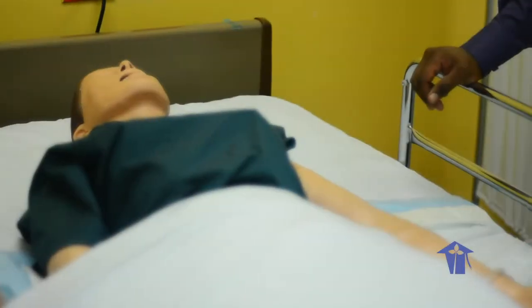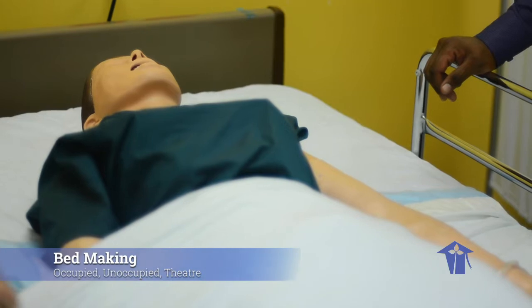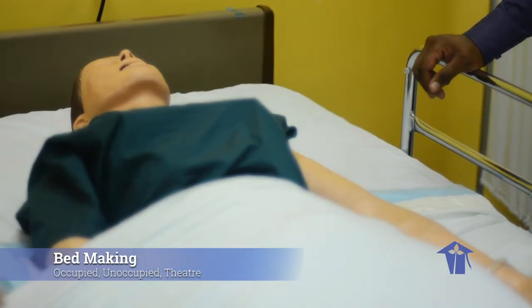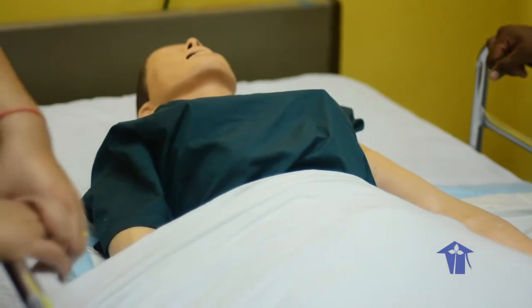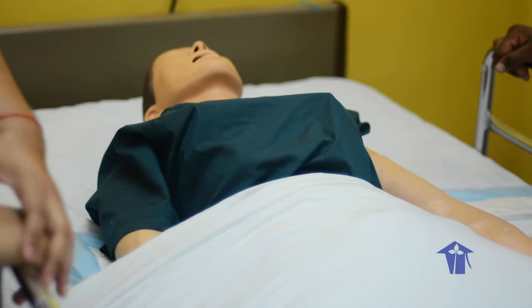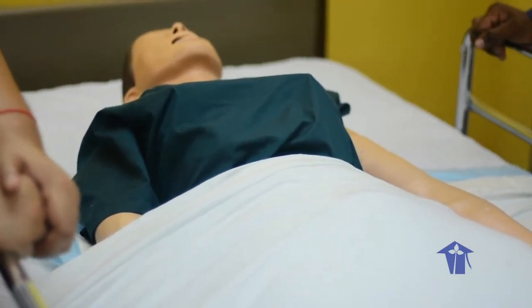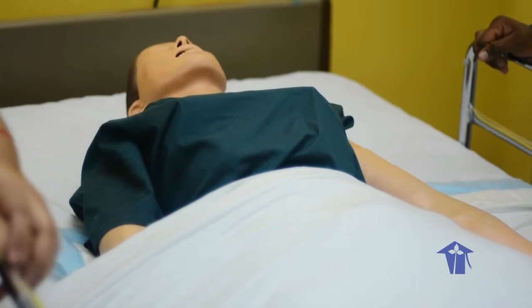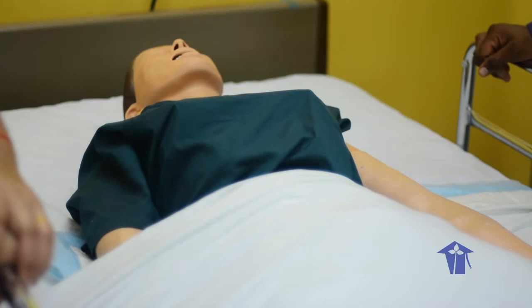Good day, everybody. So today what we are going to do is beds. Beds mean occupied bed, unoccupied, and theater bed. So first, because we have our patient, we are going to start with an occupied bed, right? Occupied bed means that somebody is in the bed currently, and obviously probably cannot move or come out of the bed for you to change the sheets. So we are going to change the sheet with the patient in the bed, all right?